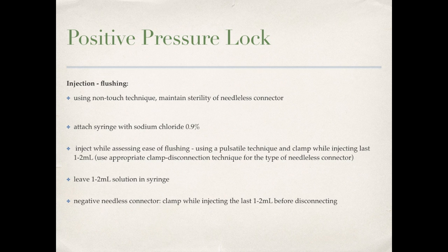Positive pressure locking creates pressure inside the lumen, which reduces occlusions, particularly thrombotic clots, from forming. And make sure to document and hand over any occlusions that have happened throughout the shift or any concerns at all to the staff taking over. And just remember, always ask questions if you're unsure of something. It's always better to be safe and get a second opinion.